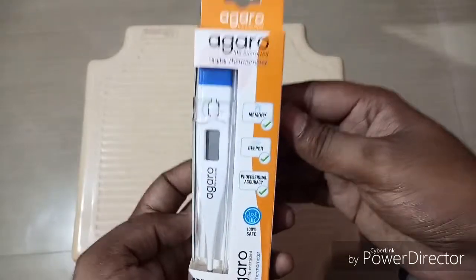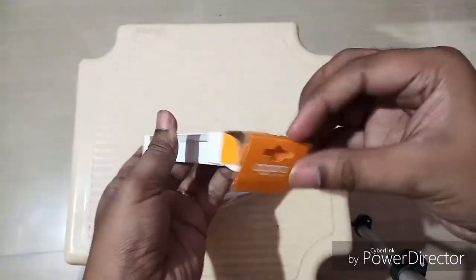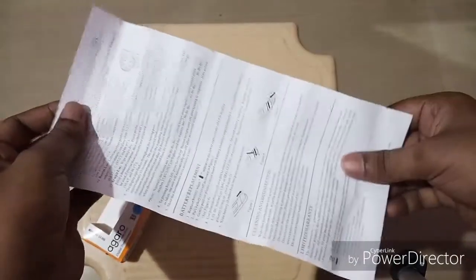Now we will do the unboxing of this product. Let's open the box and see what is inside. Inside the box, there is one digital thermometer and also a user manual or instruction booklet.